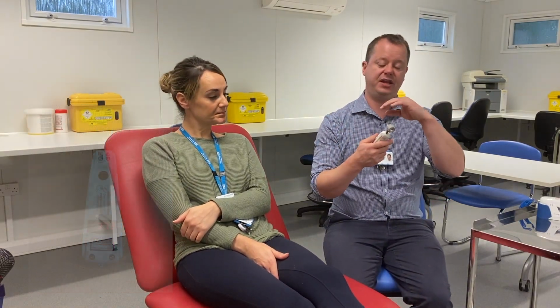So once we've done that, we don't have a cover on this machine, so we don't need to get rid of that one. We need to give it a clean, and then we can place that down, and we also need to record what that temperature is. Make sure the patient's comfortable, and make sure they haven't got any questions, and then that's it. Okay.